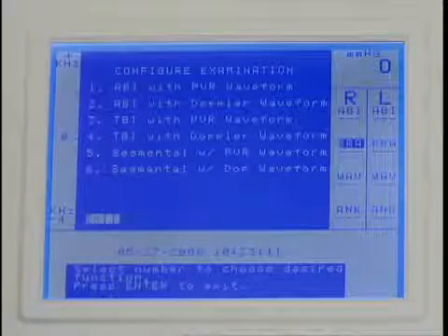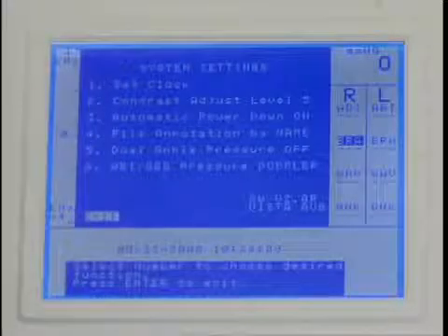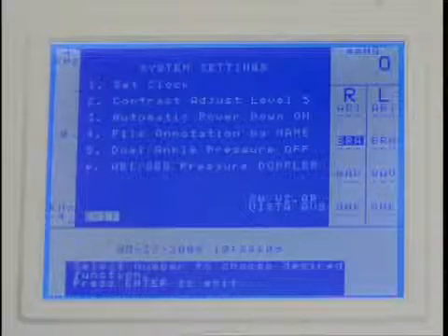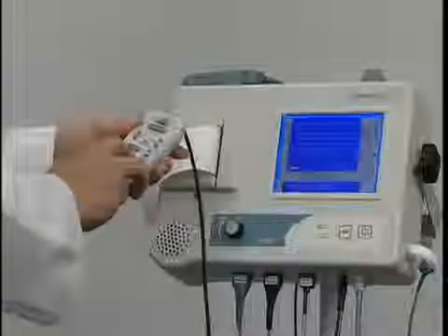Press the number corresponding to the exam type desired. The next item in the options menu is system settings. To change a system setting, press the corresponding number key. The first setting sets the date and time; use the number keys to enter the date and time.